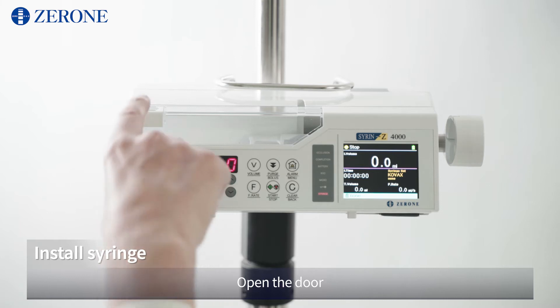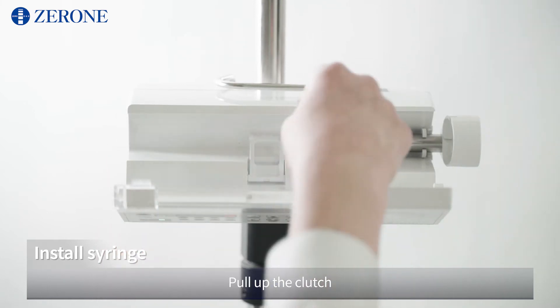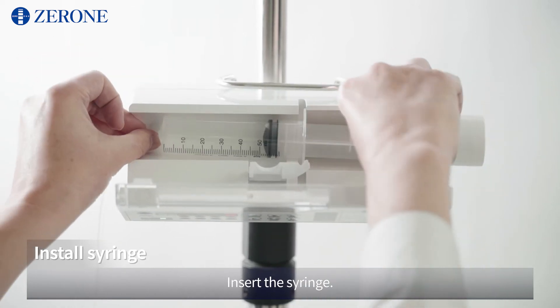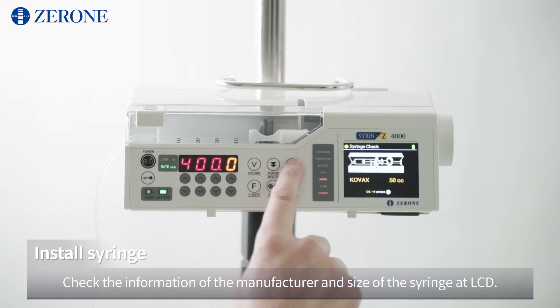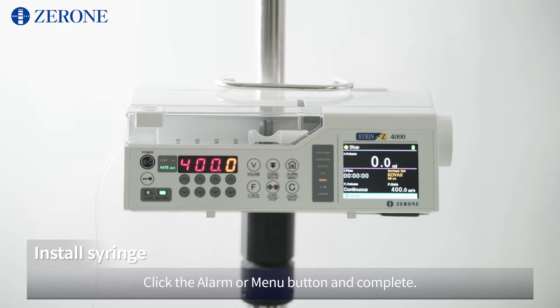Open the door. Pull up the clutch. Insert the syringe. Release the clutch. Check whether the syringe is placed correctly. Close the door and check the information of the manufacturer and size of the syringe on the LCD.